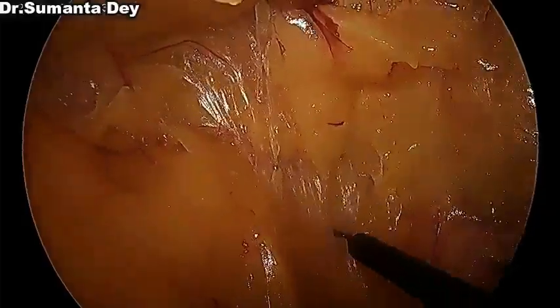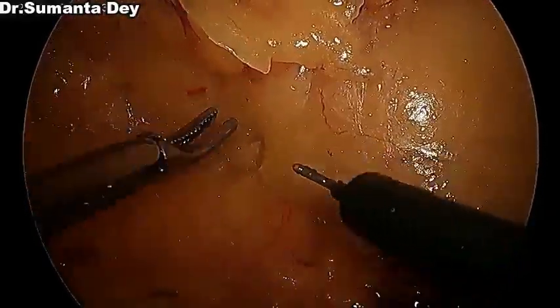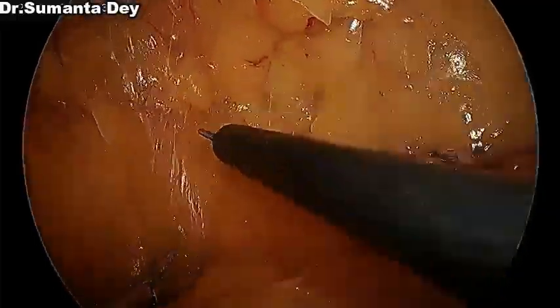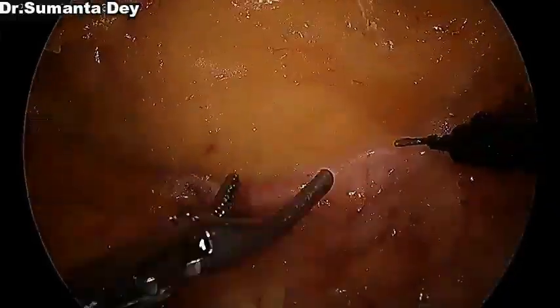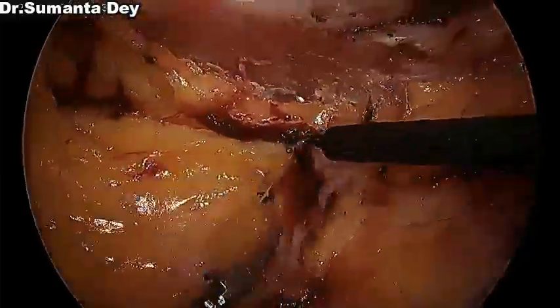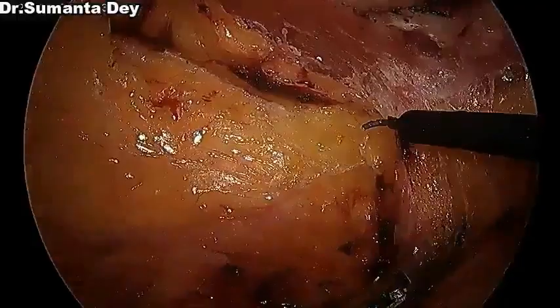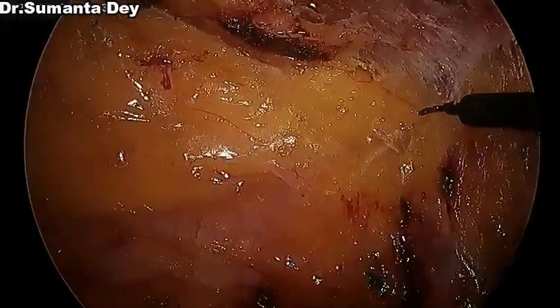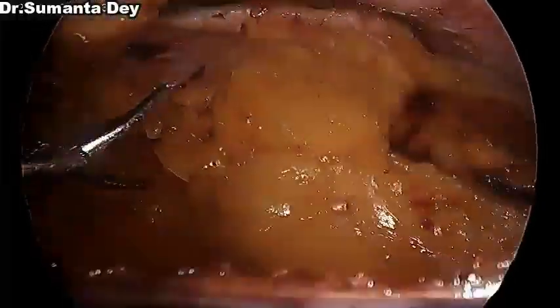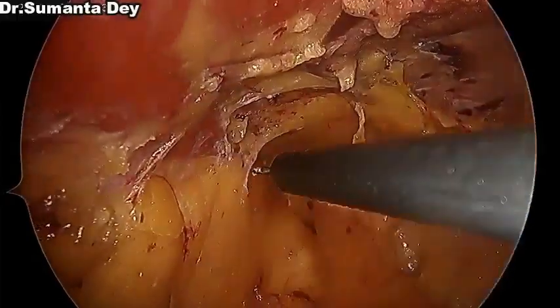And now I'm slowly getting into the space of Retzius on the pelvic side, and if you are in the correct plane, dissection is all about identifying the correct plane. I always believe that. So you can see above on the lateral aspect, again just pulling it with my left hand instrument and dividing the fascia transversalis to be in the preperitoneal plane. And now you can see I have done enough dissection on the lateral aspect.